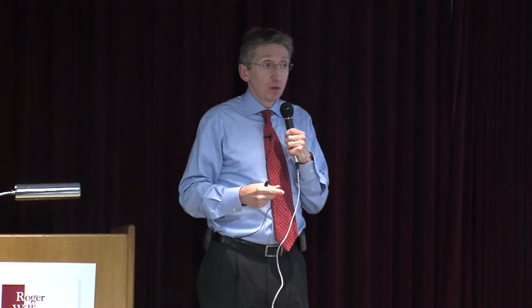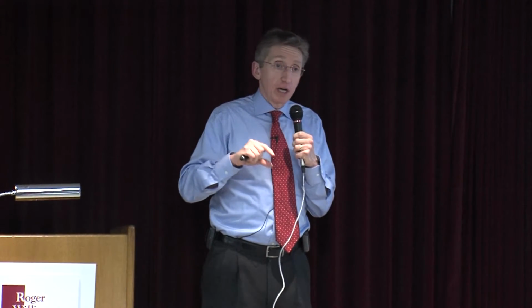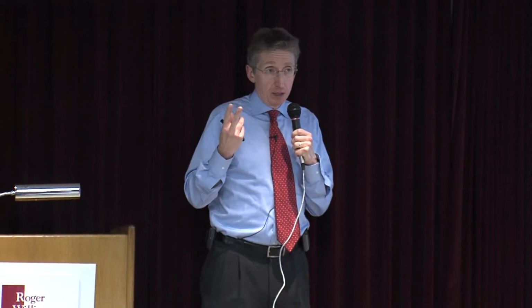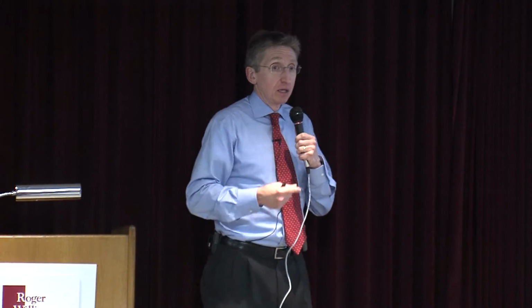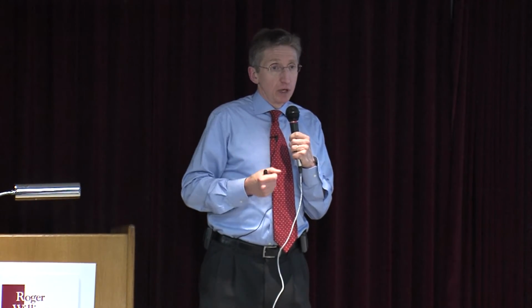Now for the upper endoscopy, you can only look into the small pouch. You cannot look into the old stomach anymore, at least for most people. There is a doctor here at this hospital actually who invented a device where he can look all the way down and then back. So he can look into the old part of the stomach, but not the easy way that you usually do.